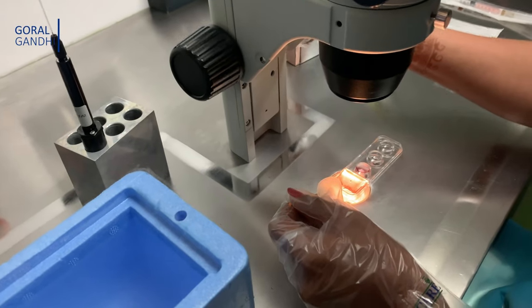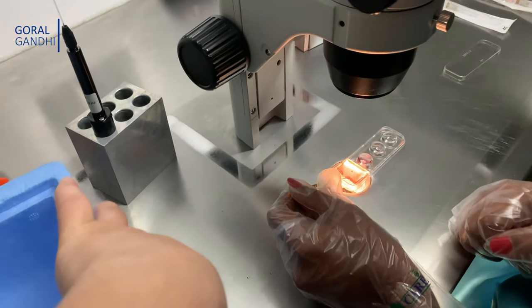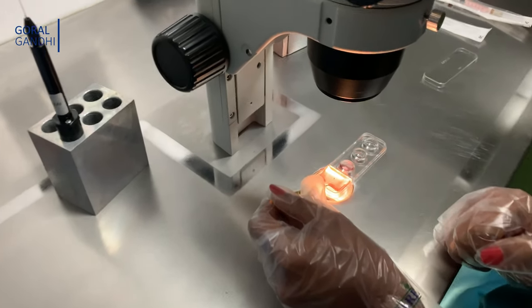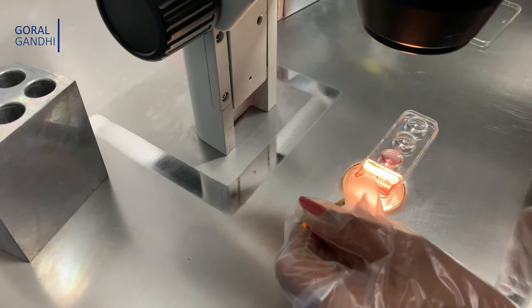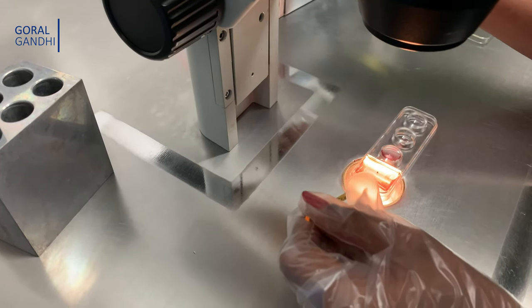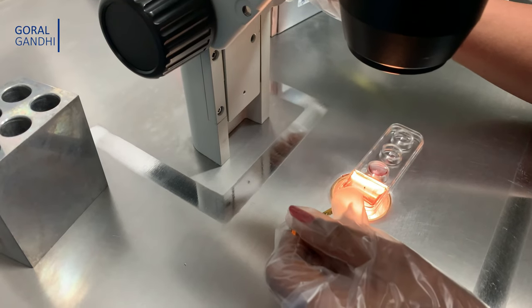I have dipped the Cryotech into the TS and I am going to keep my Cryotech still for one minute. I am not going to move my hand. The blastocyst has already come up — it has come off the Cryotech and it is in the TS. For the entire one minute I am going to keep looking at the blastocyst so I don't lose it.